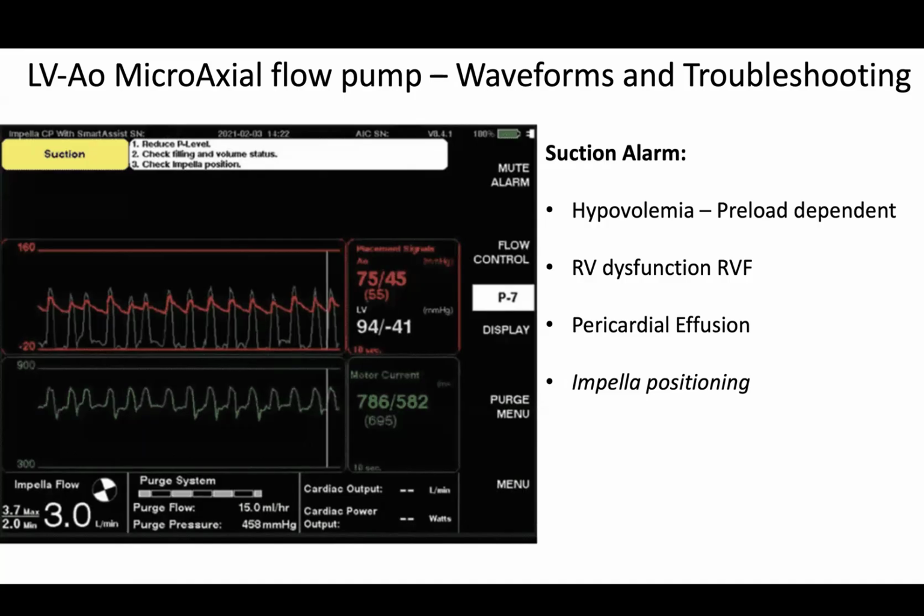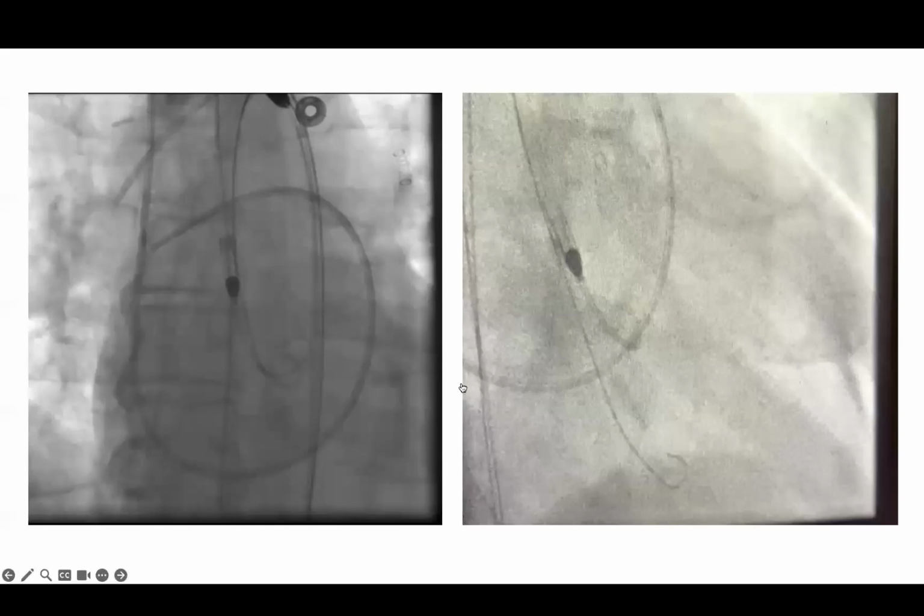Carlos, can I ask a quick question? Yeah, sure. With the new Impella, if it's in the aorta and you can't get it across, you can now rewire the sheath and not lose access, whereas in the past you couldn't. Isn't that correct? Yeah, this wire that you see here is through the repositioning sheath. So you could pull it out, put a new sheath in, and put a new Impella in. It's just the cost of the Impella. It's not a new access site, correct?